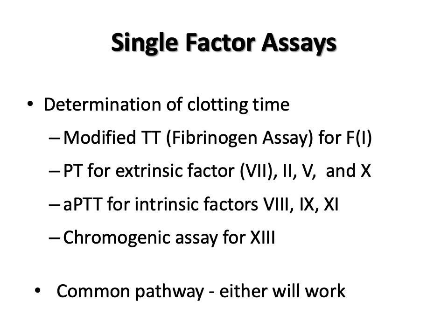Single factor assays may be part of the testing process to determine the cause of an unexpected prolonged PT or APTT. They're done after mixing studies have been performed and a deficiency of one or more coagulation factors is suspected. Factor assays are able to identify specific factor deficiencies. Think of mixing studies as being part of the screening test, while factor assays are confirmatory tests for specific factor deficiencies.